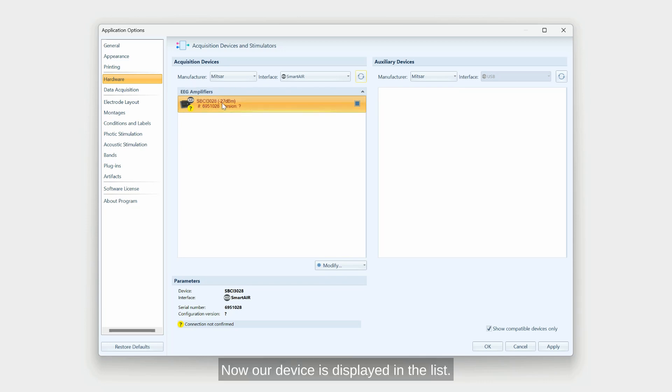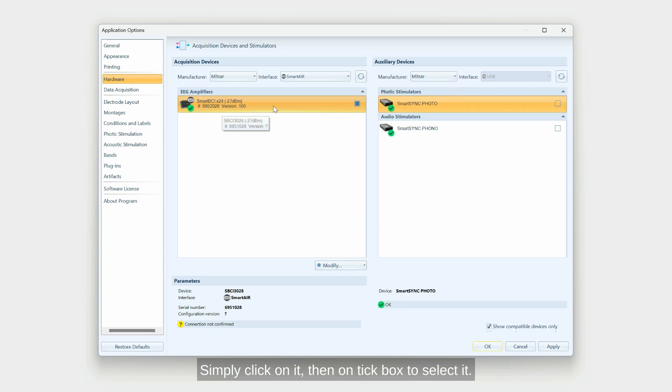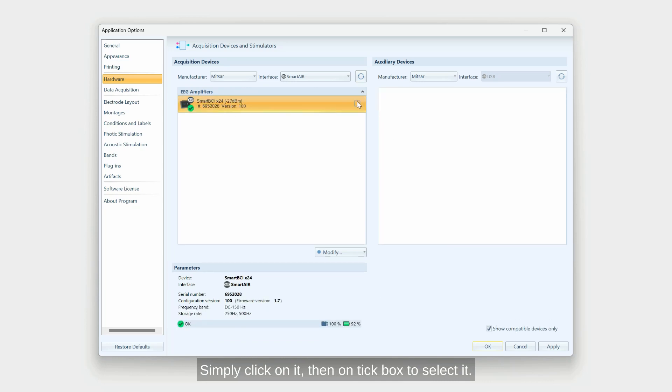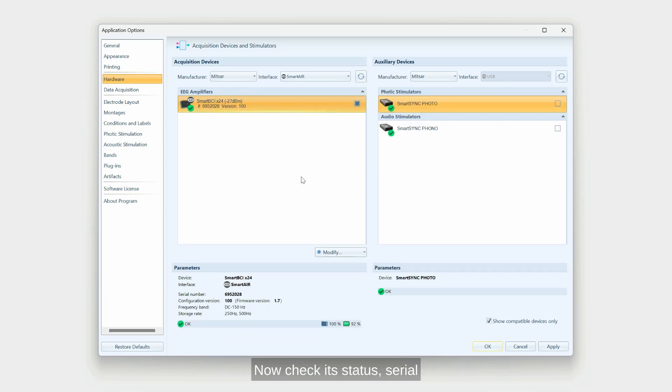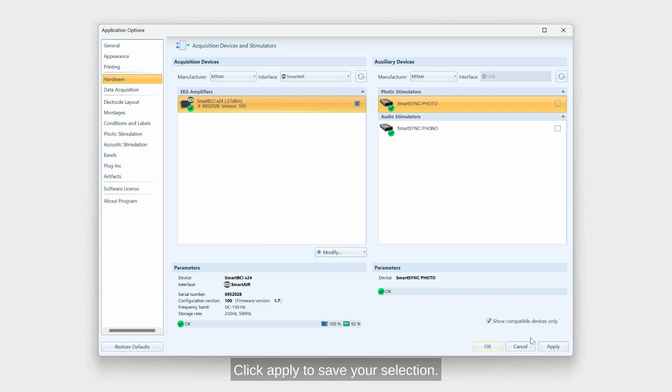Now our device is displayed in the list. Simply click on it then on tick box to select it. Now check its status, serial number and other parameters. Click apply to save your selection.